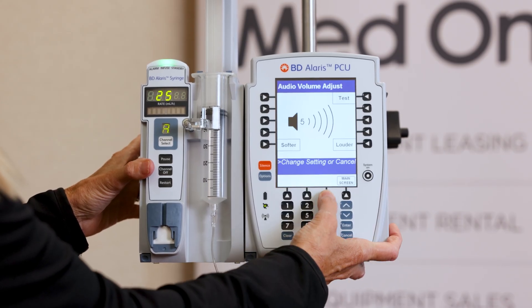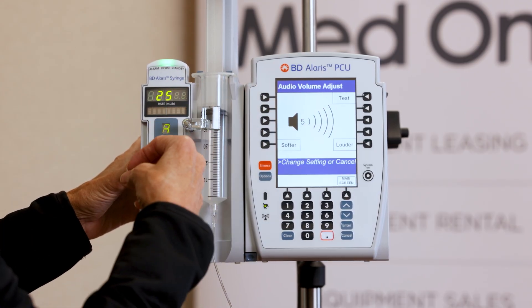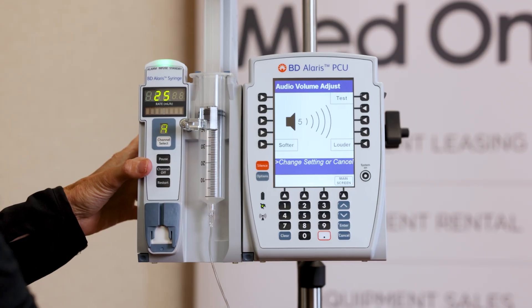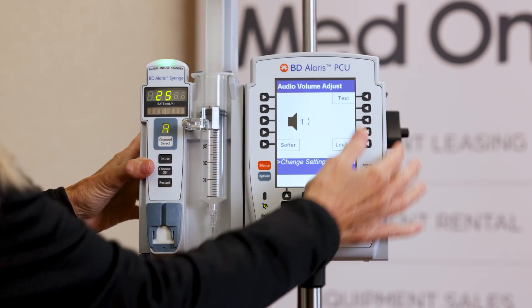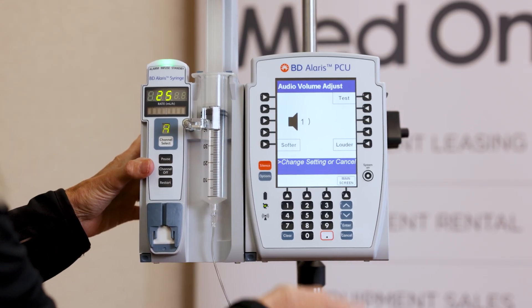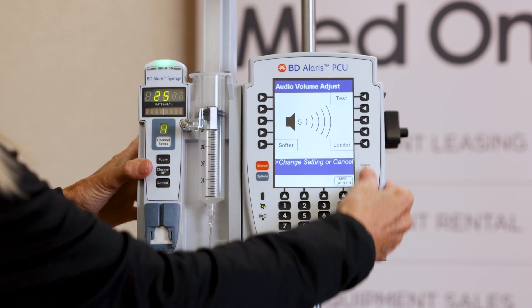Audio adjust: five is the loudest and this pump defaults to that. You can make it lower. I'll test five, then take it lower by pressing softer — this is what a one would sound like. I'll take it back up to five and press main screen.